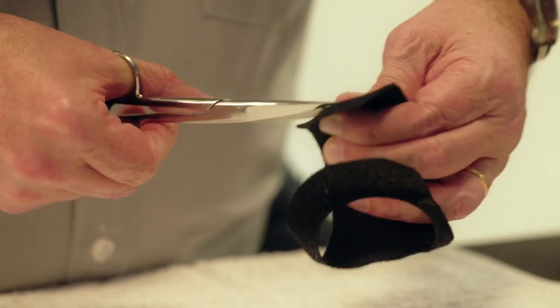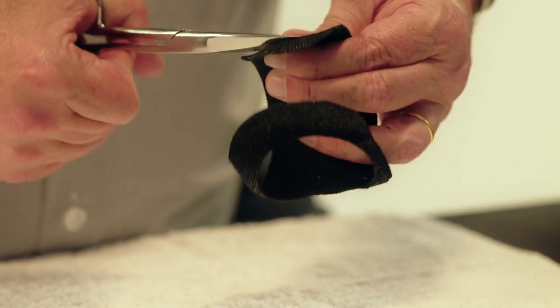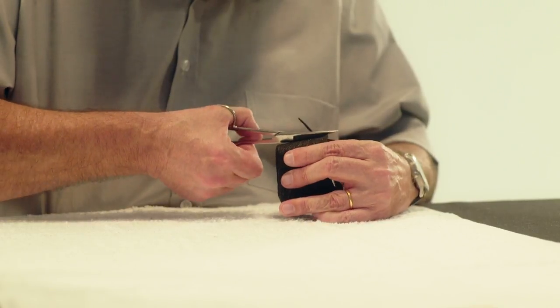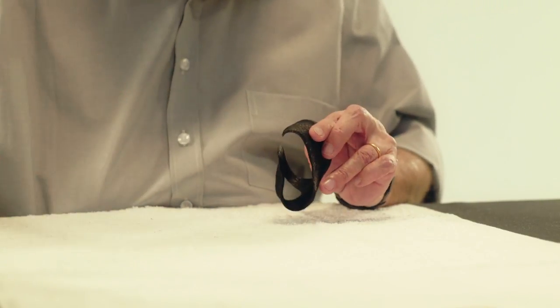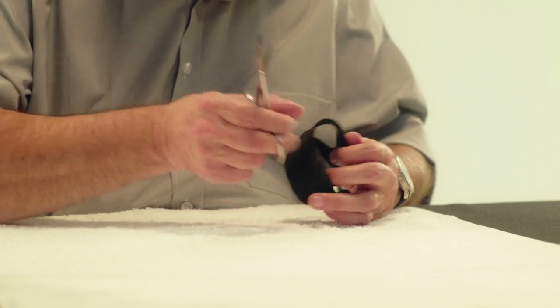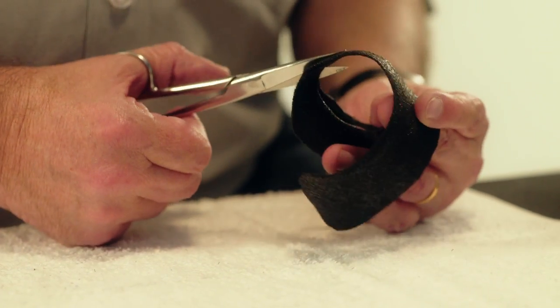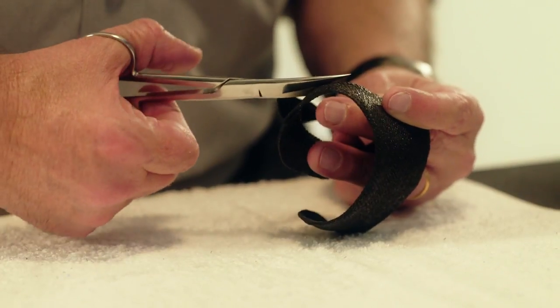Cut a slit opening on the palmar side of the orthosis which will allow a Velcro strap to pass through. Enlarge the hole for the thumb liberating as much of the thenar eminence as possible.